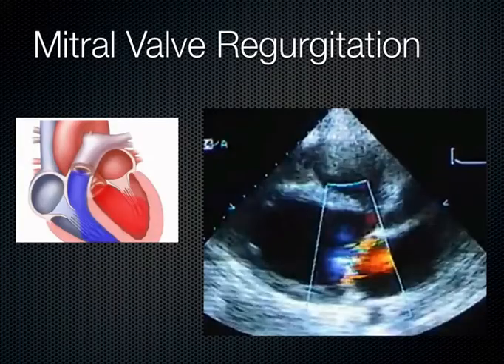But with the heart, we can use Doppler to evaluate the valves. Now, this is an example here of the parasternal long axis, just to demonstrate where that mitral valve is. And one of the things you've got to remember about Doppler, it's a little bit confusing initially, but you've got to kind of commit this to memory, is that when you work with Doppler, you can't have the Doppler assessment at 90 degrees to the angle of the sound.